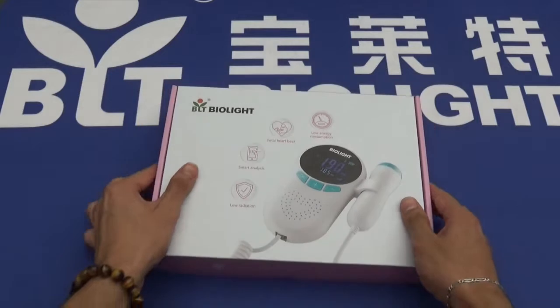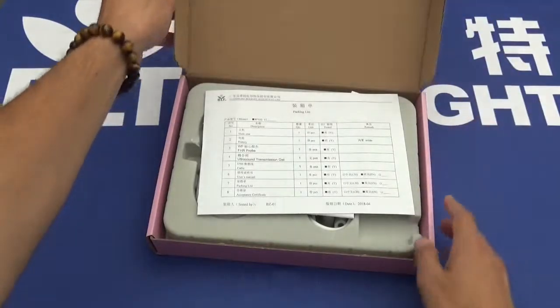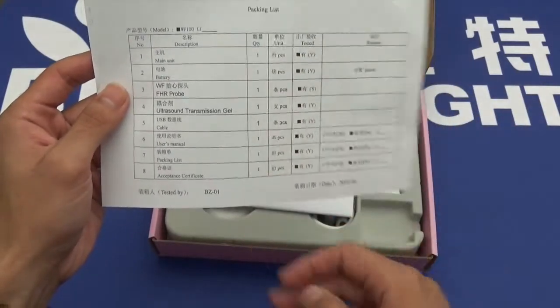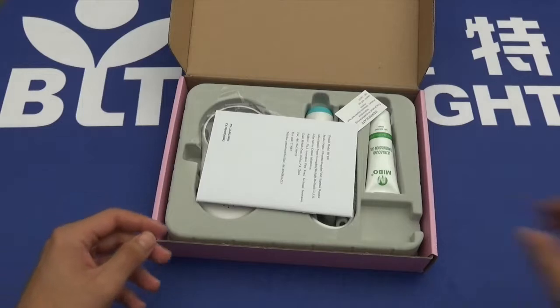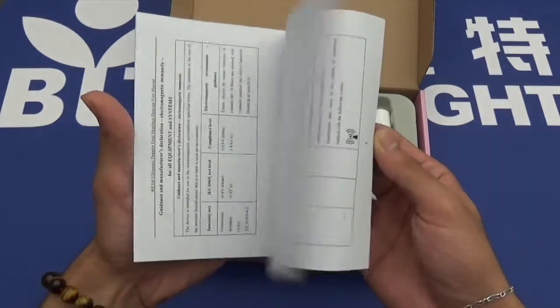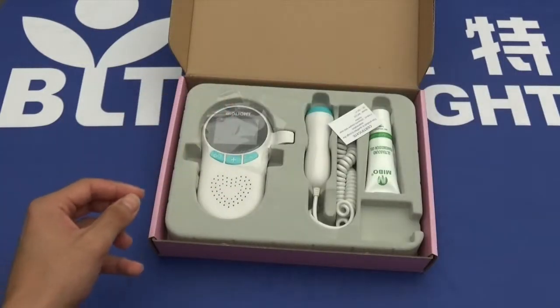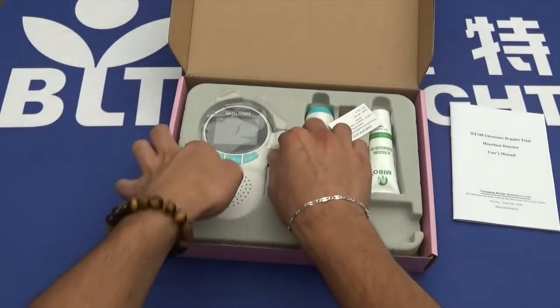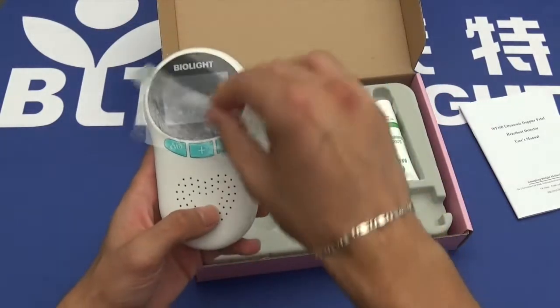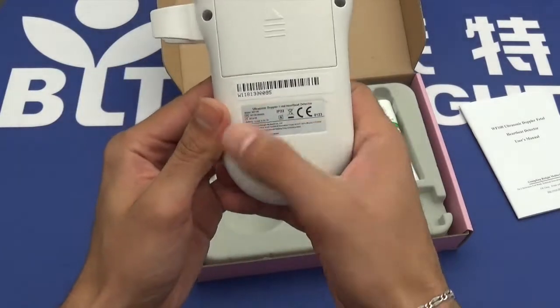Coming now to unbox the product, we're immediately greeted with a list of items the box should contain. Putting this to one side, we have the product manual, which tells you everything you need to know about using and maintaining this product. We then have the device itself — Biolight — with some product information on the back.